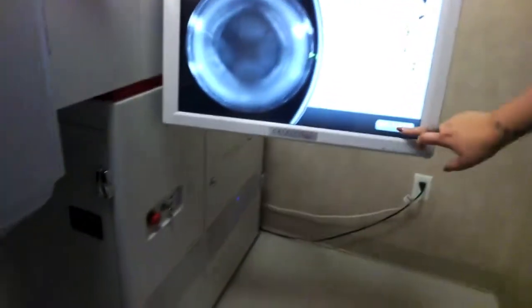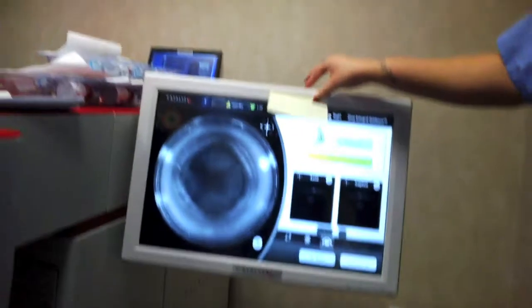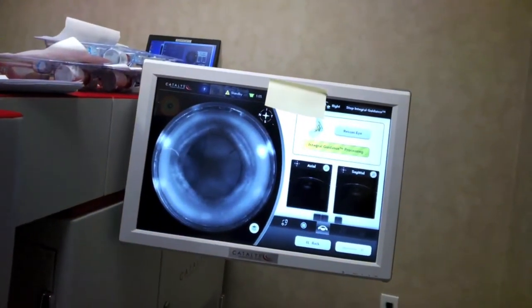We're all attached to the laser. We're going to get some images of your eyes — these images take about a minute, and then we'll get started. No more talking. Don't move your chin, don't move your jaw. Nice deep breaths. You're doing really well. Everything looks perfect.